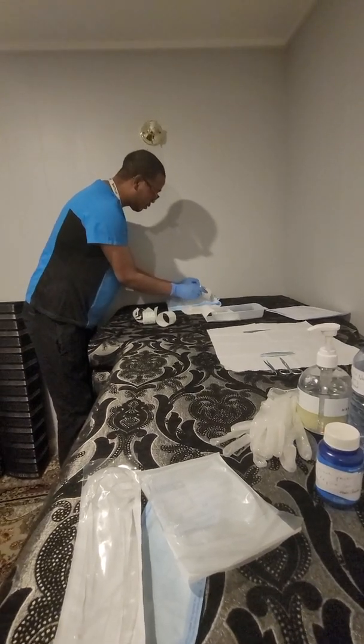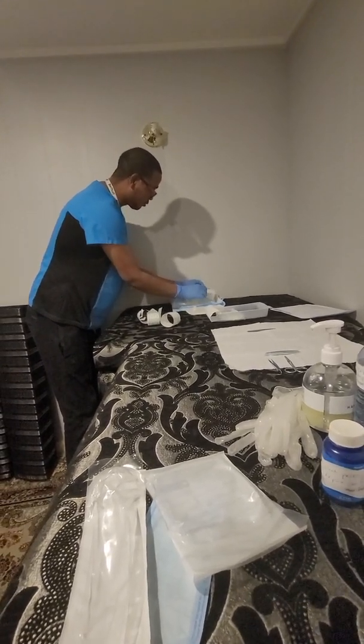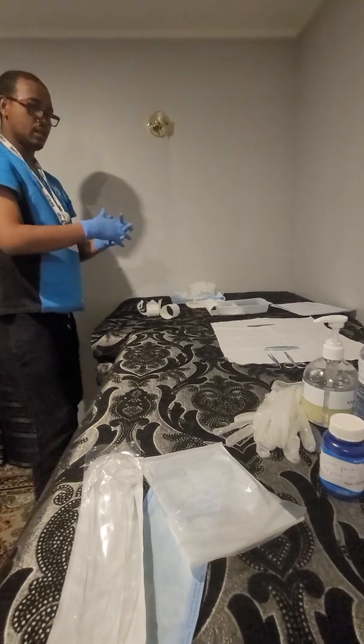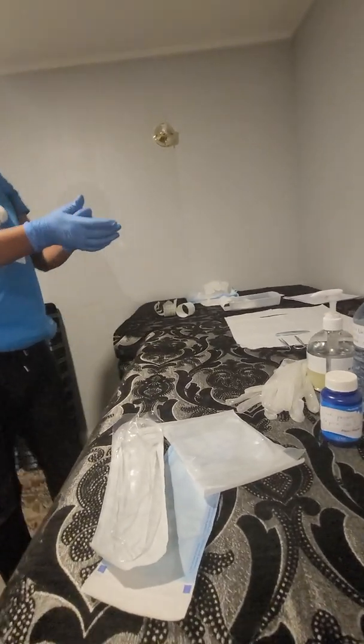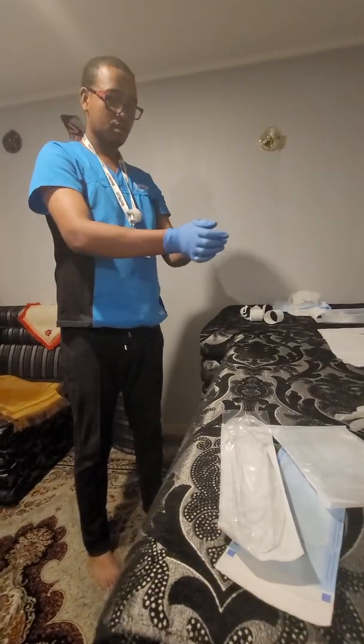Then the middle. Now what is left is just the date and time. I'm gonna remove my gloves.